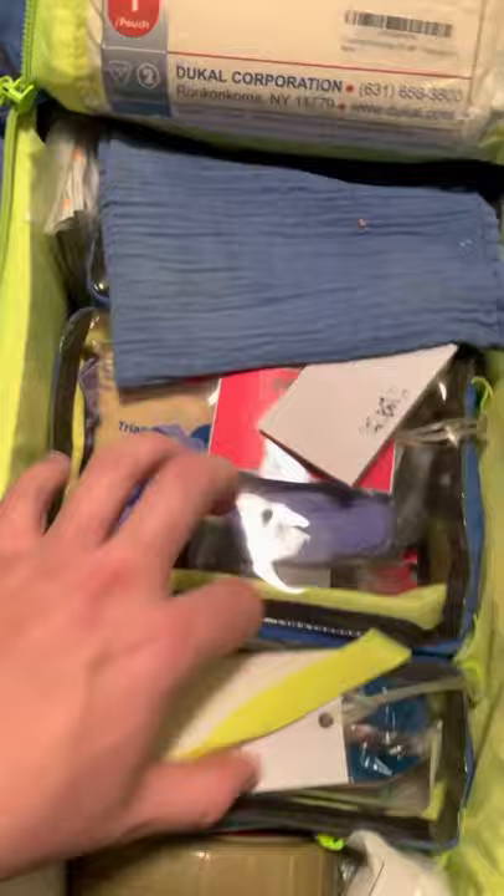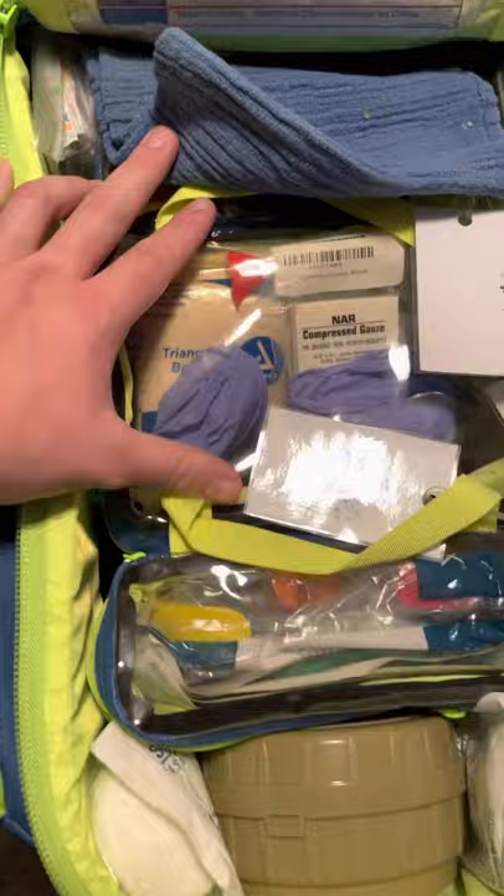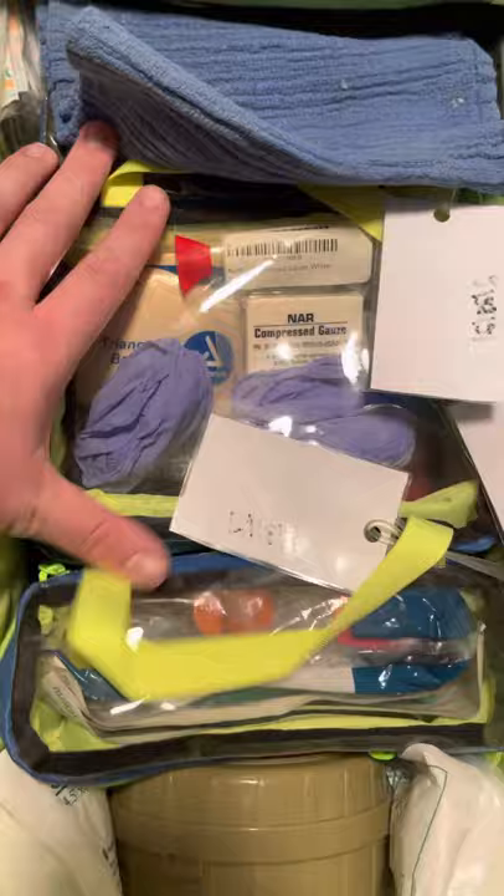This middle compartment is my trauma bag — my stop-the-bleed bag. It's going to have my gloves, compressed gauze, triangular bandages, a tourniquet, HyFin chest seals, Israeli bandages, and anything else I might need for stopping the bleed. I always have a trusty towel — I carry one on the bench too, but it's always good to have another one in case I grab the kit and don't happen to have a towel with me.